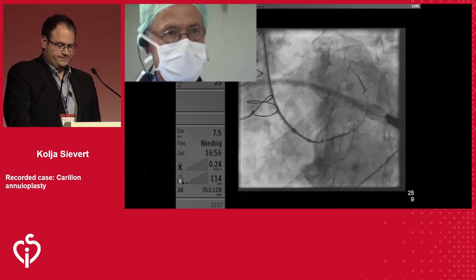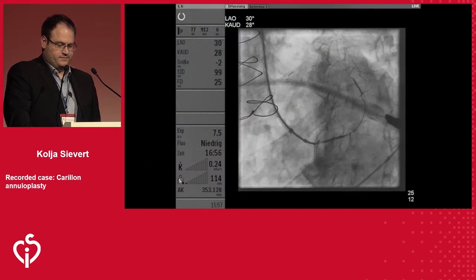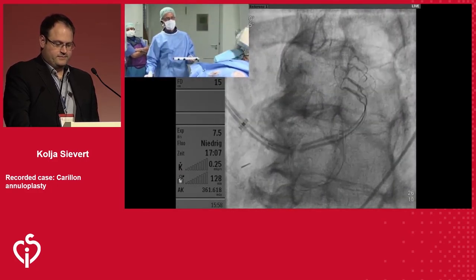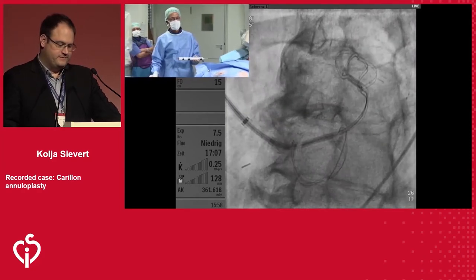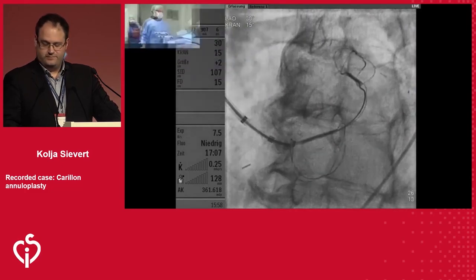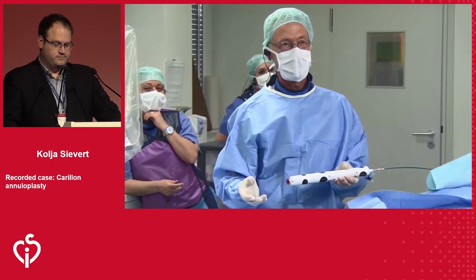Well, I think it's locked. You know, the best way to check, though, a nice projection to do that is the LAO cranium. Yeah, so I'd say it's locked in this image. There is a little bit of play there, but that's about the appropriate distance for it. And in this image, too, we can see the arrowhead, which is the locking feature that stabilizes the anchor. So I'm convinced. So we are ready to release.